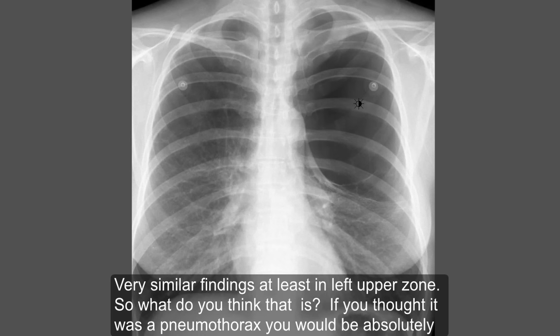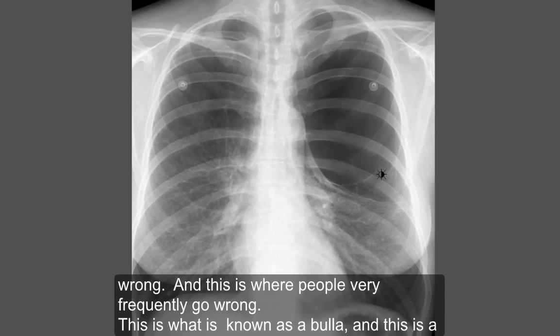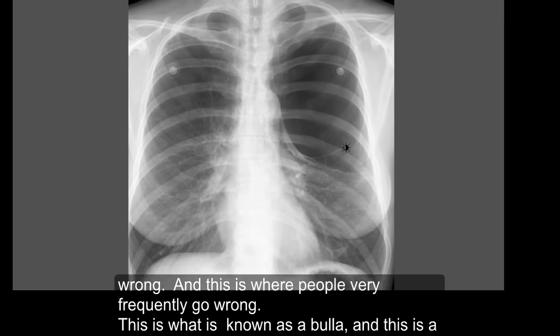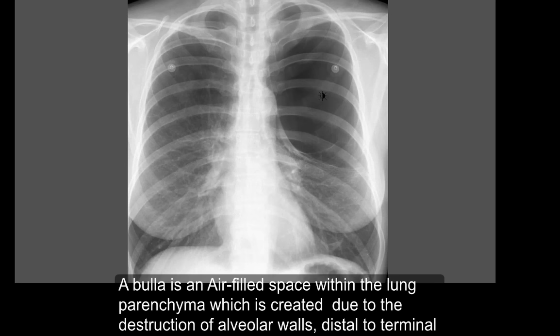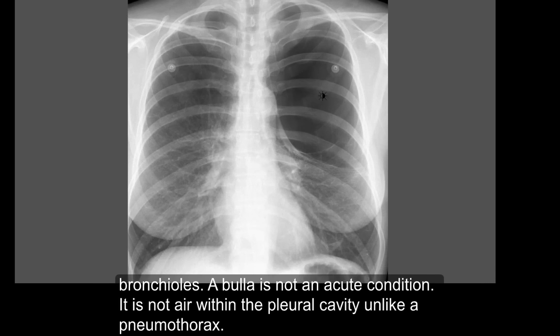There are very similar findings, at least in the left upper zone. What do you think that is? If you thought it was a pneumothorax, you would be absolutely wrong — and this is where people very frequently go wrong. This is what is known as a bulla, and this is a very large one. A bulla is an air-filled space within the lung parenchyma, created due to the destruction of the alveolar wall distal to the terminal bronchioles.